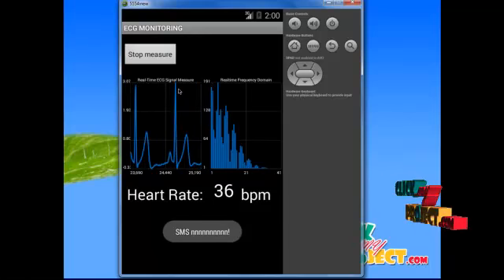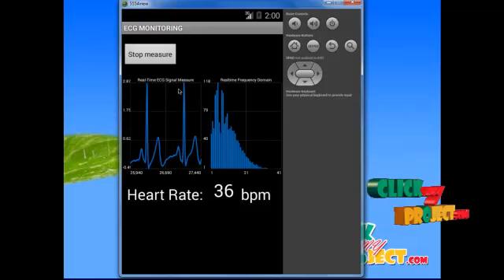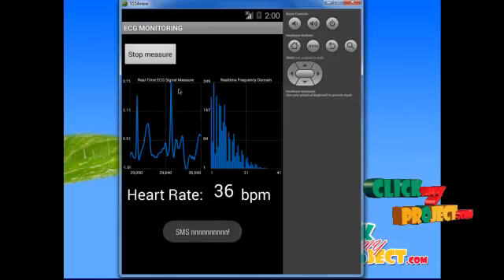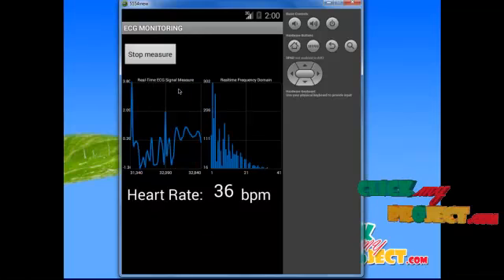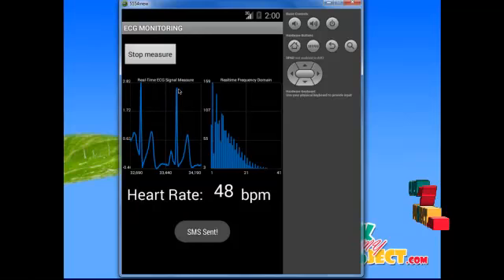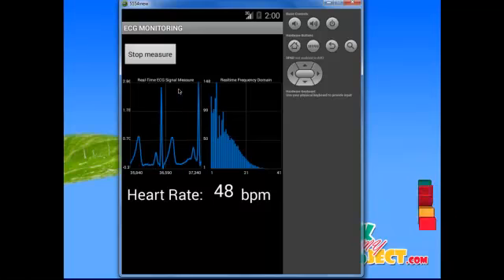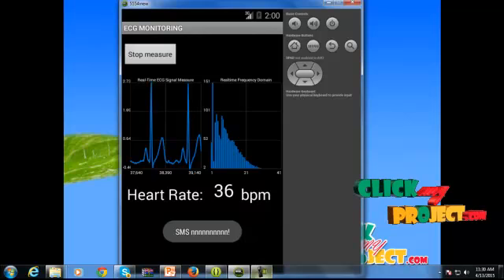We will analyze the ECG wave by counting the spikes in each cycle of the ECG wave. The higher spike value is calculated and compared with the threshold values. If it is not between the thresholds, an alert is generated. After that, the smartphone reads the output received from the dataset module and displays it on the screen. The ECG packet will be decoded and plotted using Java. After plotting, if the value is critical, an SMS will be automatically sent to the doctors.